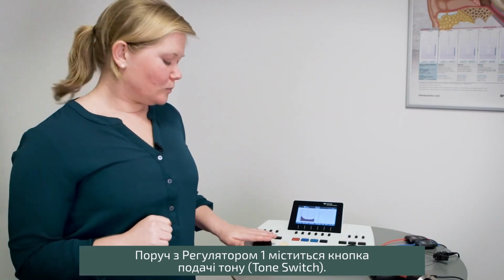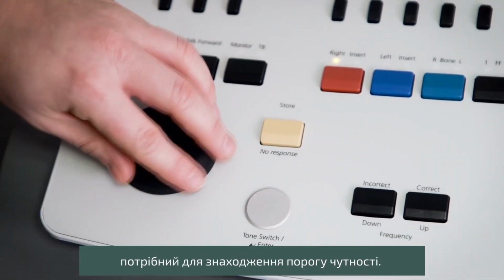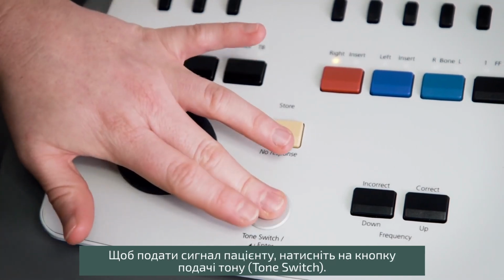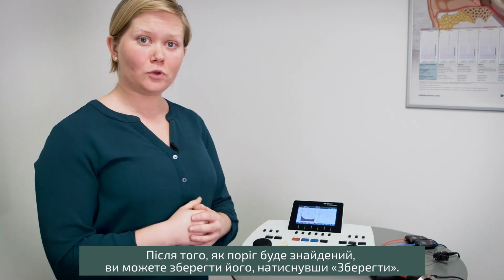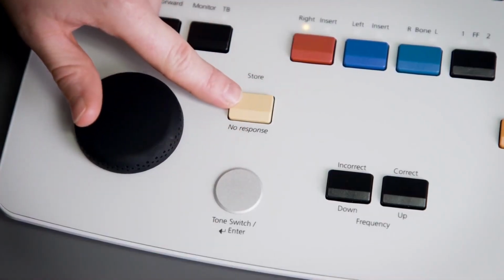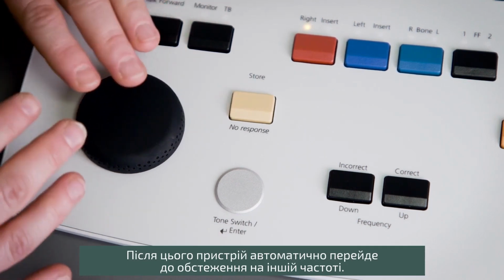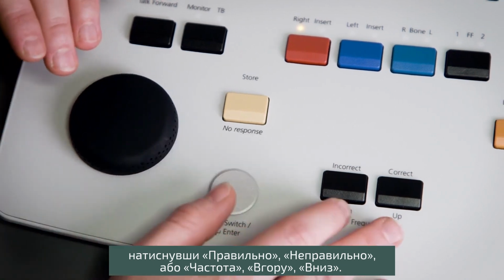Also around wheel 1 you have the tone switch so that you can increase and decrease the level until a threshold is found by presenting the tone to the patient pressing the tone switch. When a threshold is found, you can store the threshold by pressing store. The device itself will then automatically jump to the next frequency, or you can do it manually by pressing correct, incorrect or frequency up, down.